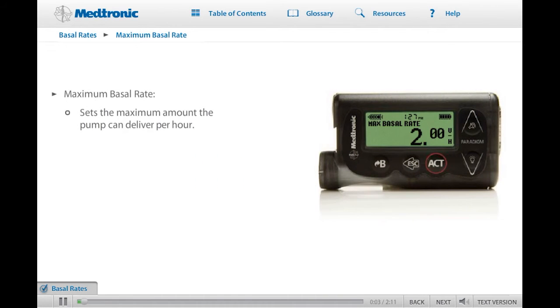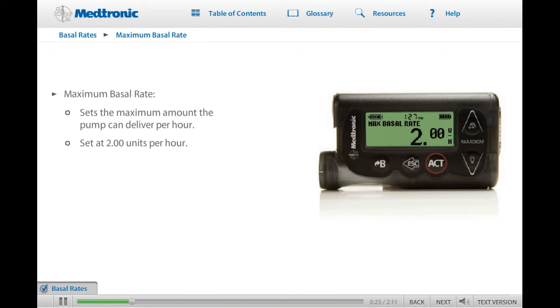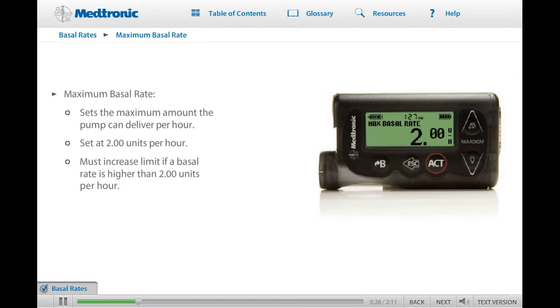The maximum basal rate feature is a safety feature that allows you to set the maximum amount of basal insulin you want your pump to deliver in an hour. The pump is shipped from the factory with the maximum basal rate set at 2.0 units per hour. This means that if you try to enter a basal rate greater than 2.0 units per hour, your pump would not allow you to do so. If you need to set a basal rate higher than 2.0 units per hour, you will need to increase the maximum basal rate limit. You should discuss this with your health care provider before changing the maximum basal rate limit.